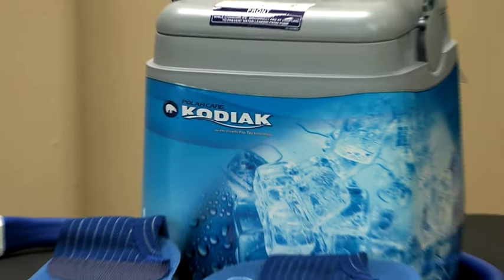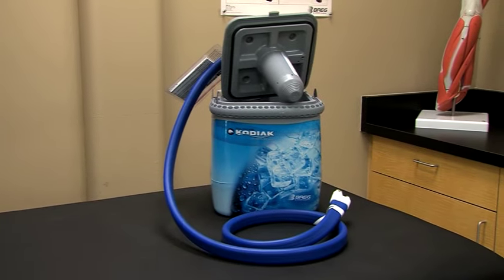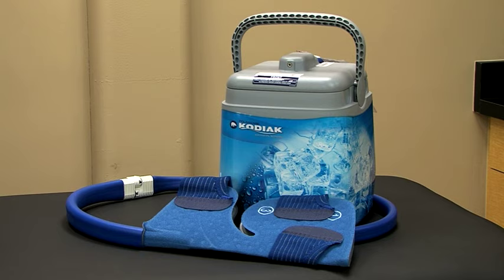This is PolarCare Kodiak, one of the best-selling, reliable, motorized cold therapy systems available today. Kodiak provides your patients with a new level of convenience and pain relief.